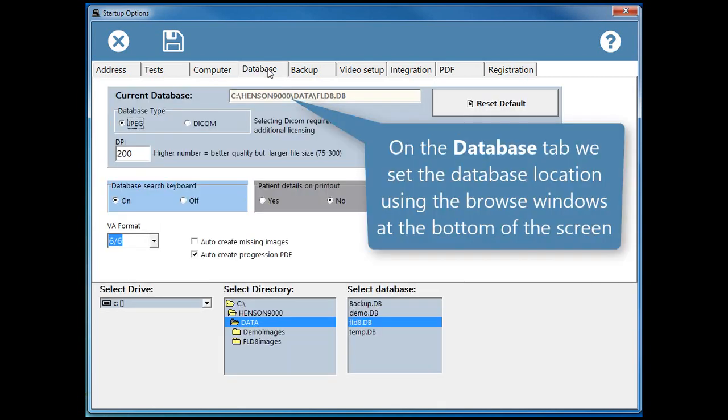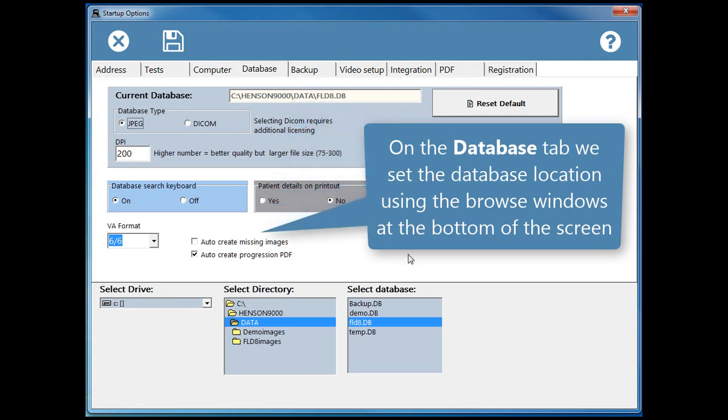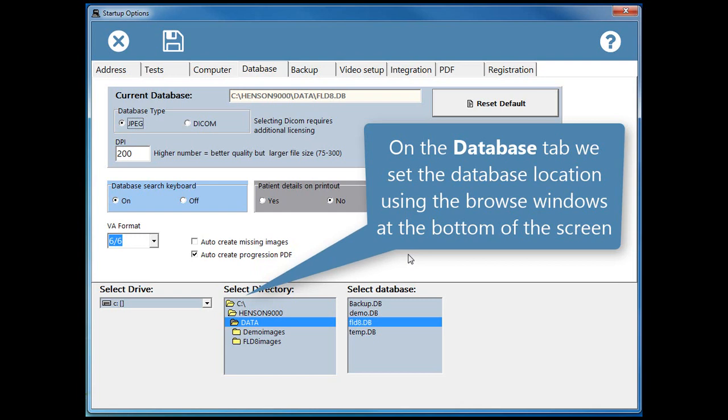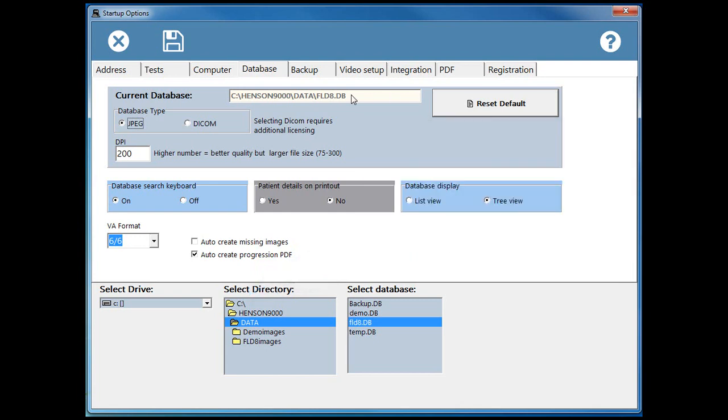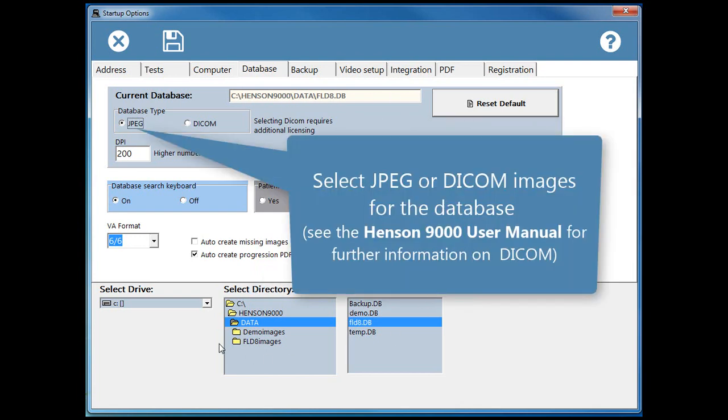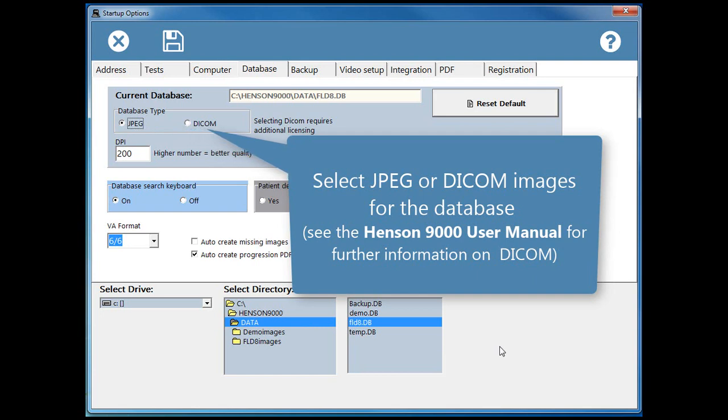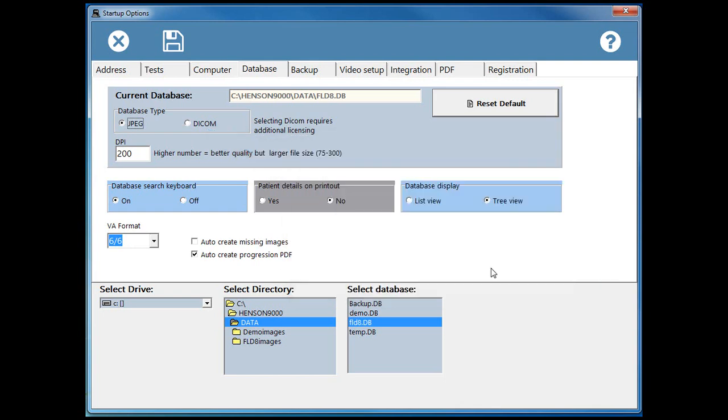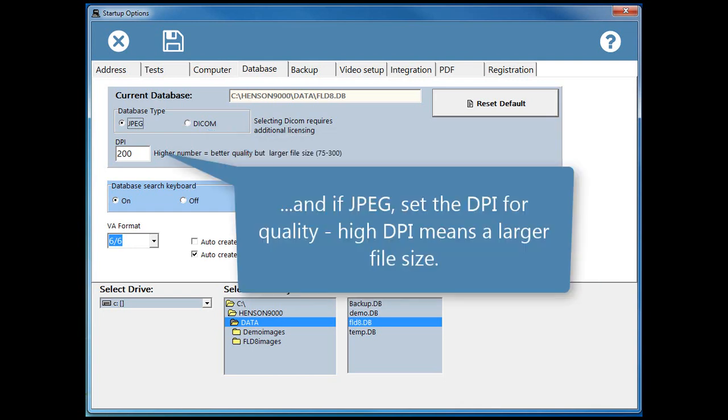On the Database tab we can set the database location using the browse windows at the bottom of the screen. Select JPEG or DICOM images for the database. See the Henson 9000 user manual for further information on DICOM. And if JPEG, set the DPI for quality. High DPI means a larger file size.